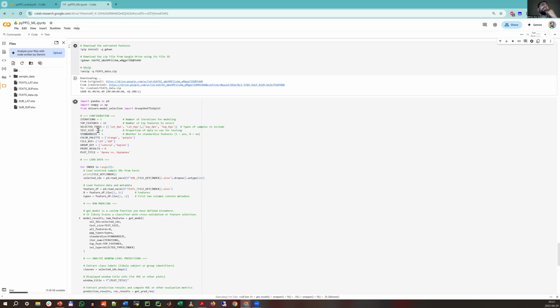I selected the top 10 features. You might remember that I mentioned that I used recursive feature elimination, and our selected types are the lateral apnea and lateral hypopnea. So here we compare the apnea versus hypopnea in lateral, and the other categories are the supine apnea and supine hypopnea, where we compare apnea and hypopnea in supine position.